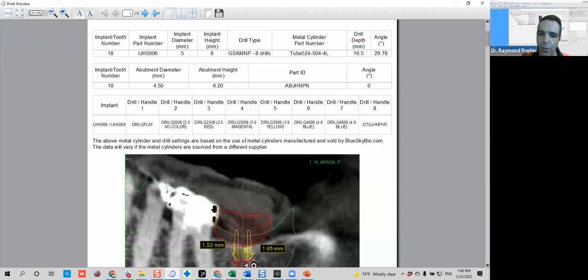And actually, when you get more experience using this one, you can start with the 2, then the 2.5, then you can start 1 and 1 and finish with it, okay? And always do, as you can see here, the 6mm drills, and then at the end, once you achieve your width, then you start making your depth. So you will do horizontal osteotomy first and then vertical, right?